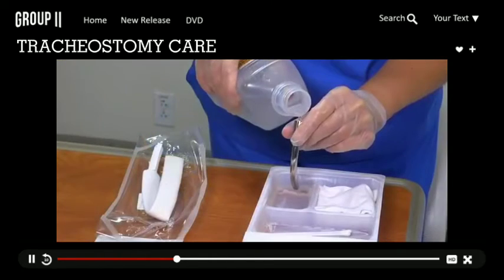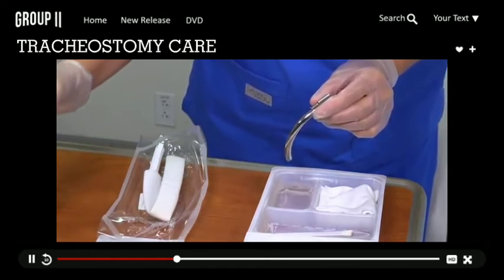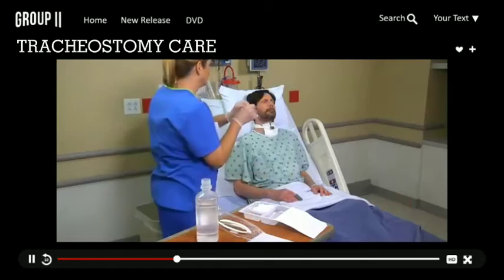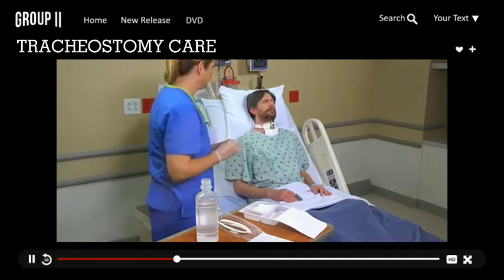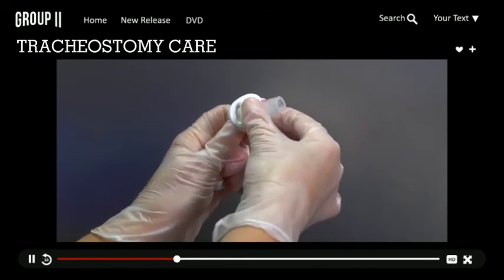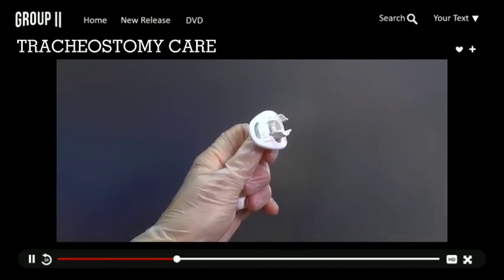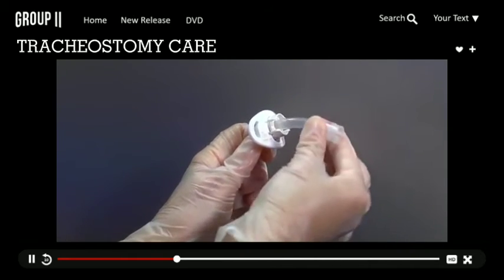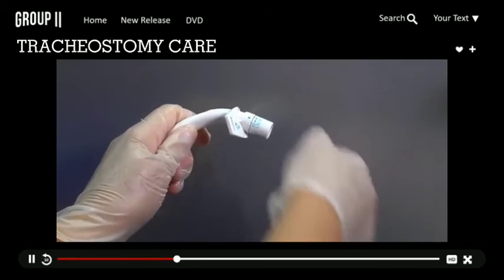Then rinse it with normal saline. Replace the inner cannula and re-engage the locking mechanism. If necessary, reattach the oxygen source and hyperoxygenate the patient. Note that tracheostomies may lock in different ways. Some must be squeezed to release and reattach, while others are secured by twisting into position.